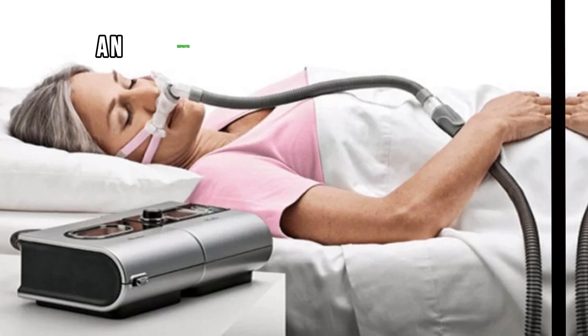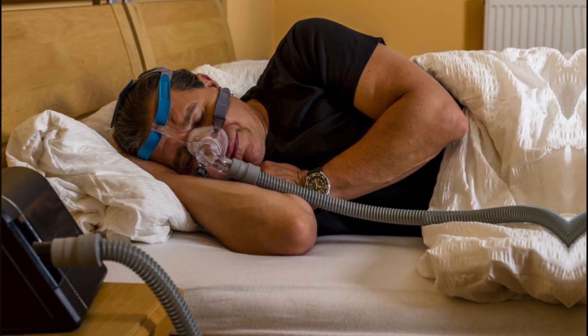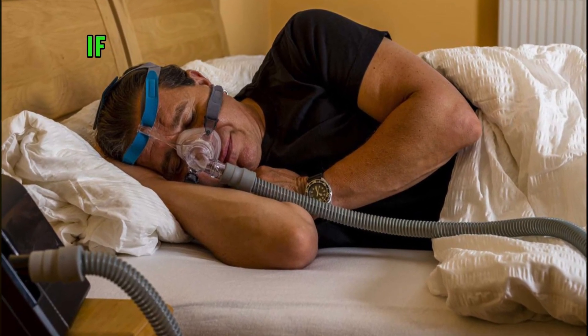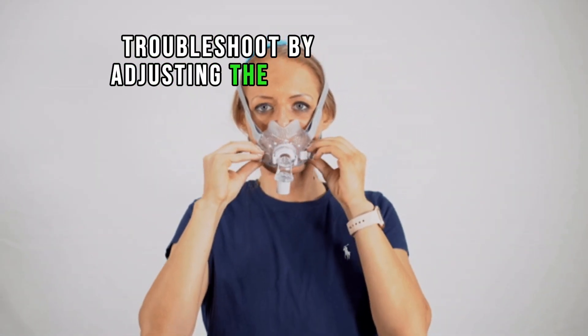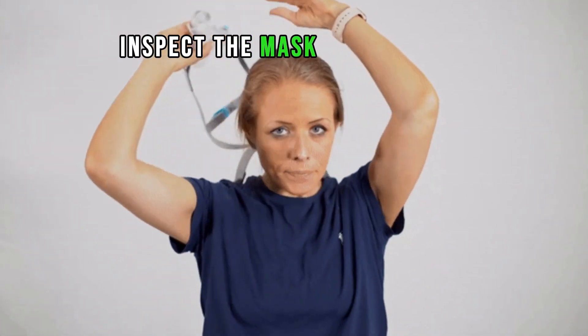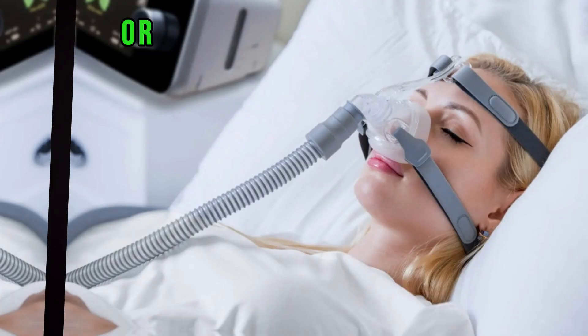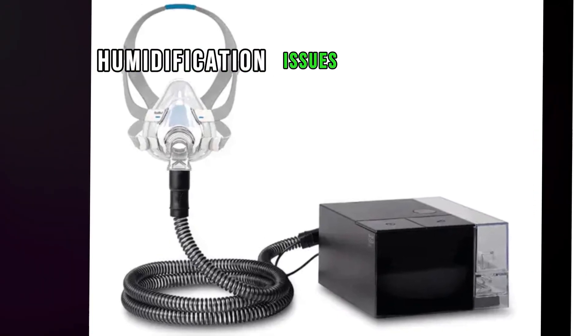An improper mask fit can lead to air leaks. If you notice air leaks around the mask, troubleshoot by adjusting the mask or replacing its components. Inspect the mask cushion, nasal pillows, or other sealing components for wear and tear.